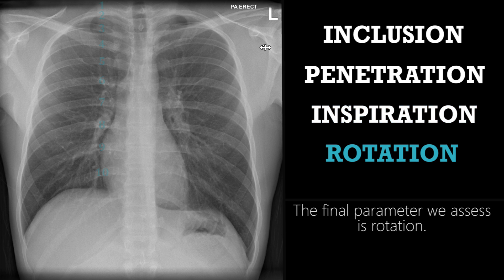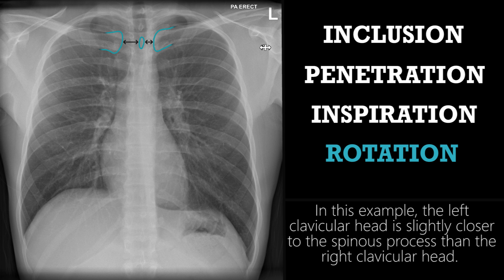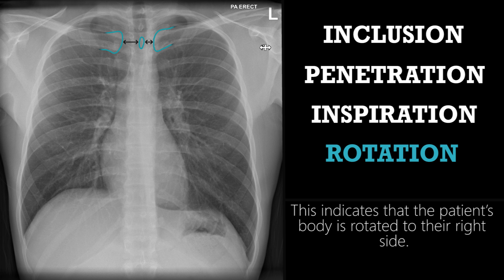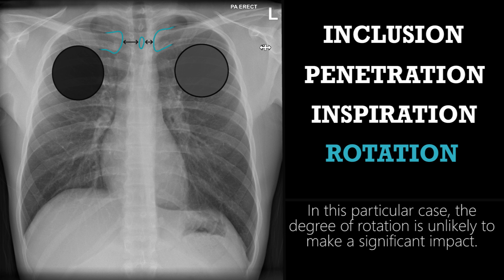The final parameter we assess is rotation. In a non-rotated image, the clavicular heads should be equidistant from the spinous processes. In this example, the left clavicular head is slightly closer to the spinous process than the right clavicular head. This indicates that the patient's body is rotated to their right side. Rotation to the right means the right lung will appear lesser than the left, and therefore blacker. In this particular case, the degree of rotation is unlikely to make a significant impact.